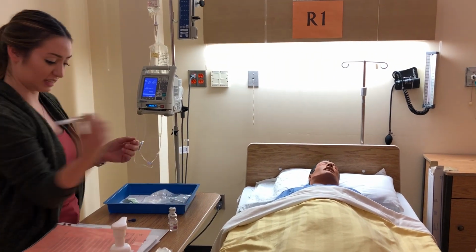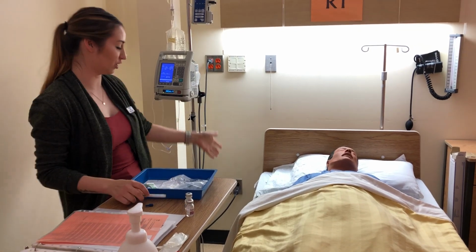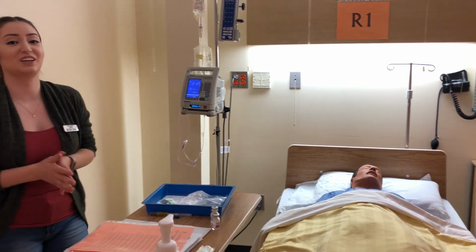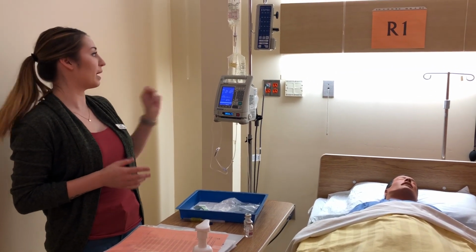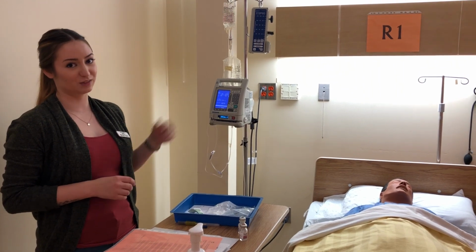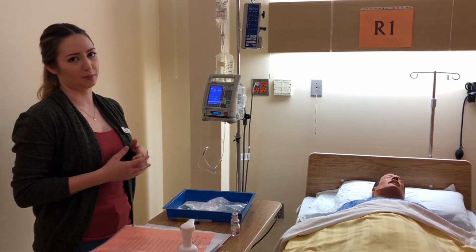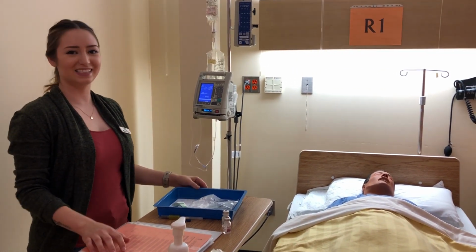I'm going to document that I gave the medication, perform an exit safety check, so I'll give her call bell. And once it's all done infusing, I'm going to come back and check to make sure that the primary bag has kicked in and it's running again. I'm going to come back in about 10 minutes though, just to check up on her and make sure it's still running smoothly. So yeah, I think that's it.